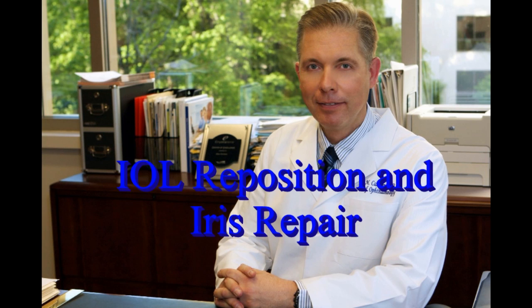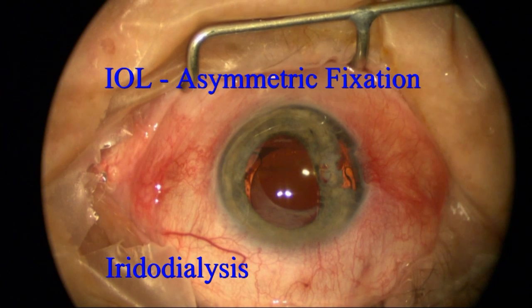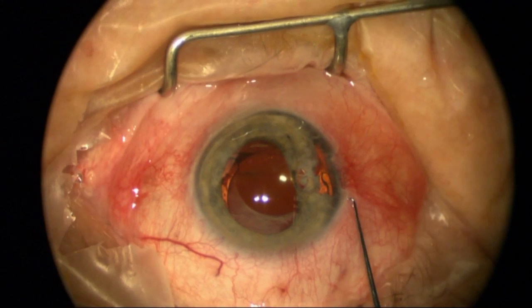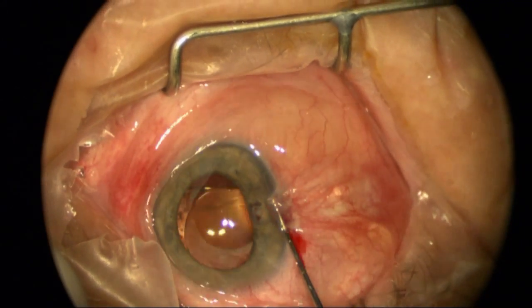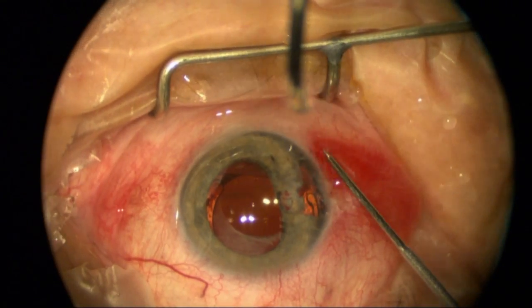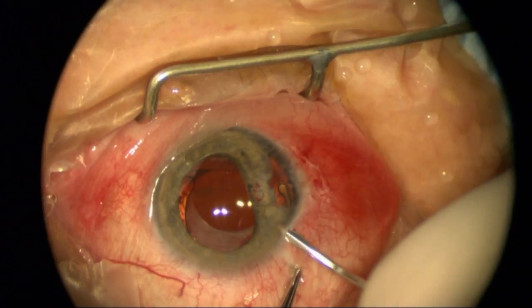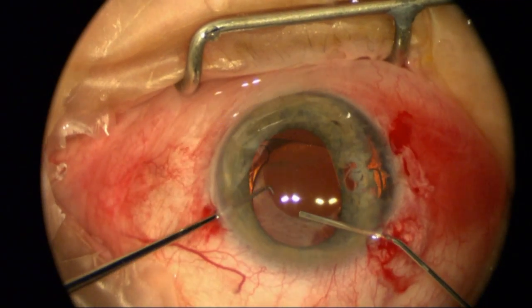This next patient is a complex patient sent after previous cataract surgery. You can see an intraocular lens that is asymmetrically fixated, along with quite a bit of iris injury with even conjunctiva scarring up to the wound in a pterygium-like process, which I'm removing. I'm doing very light cauteries, as I don't want a recurrence of much inflammation and scarring. Now creating paracentesis ports.